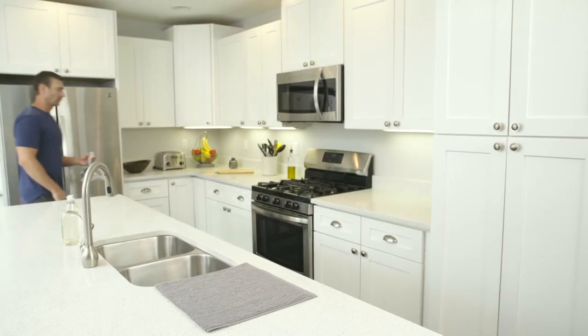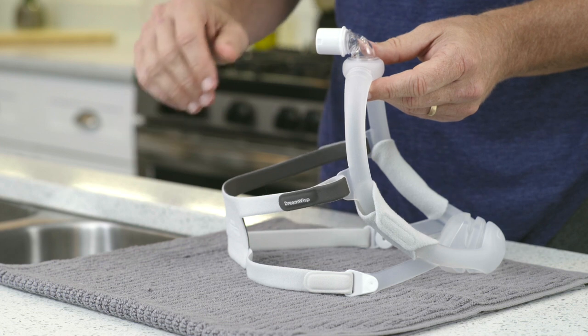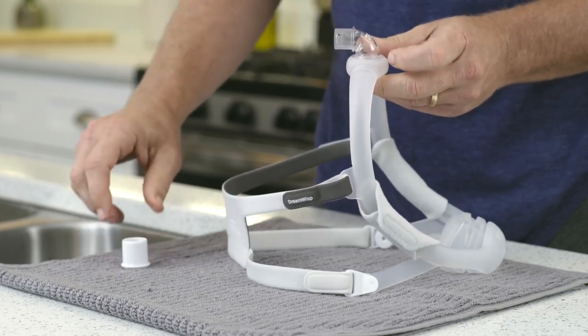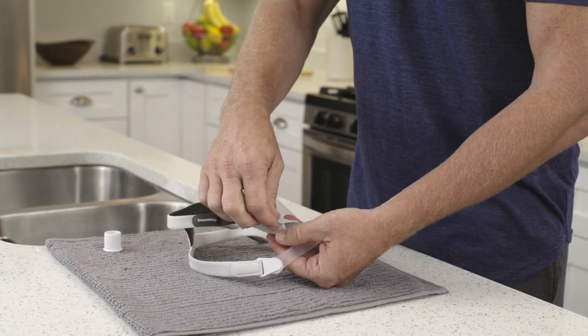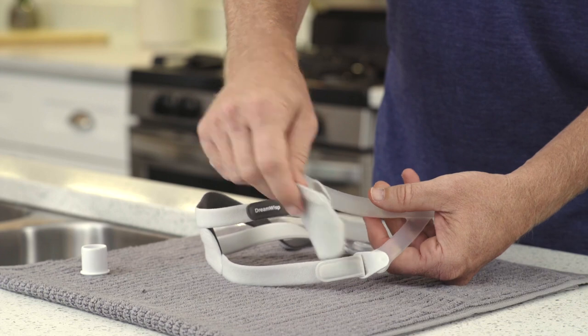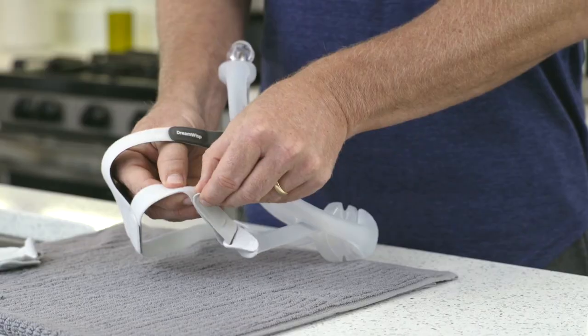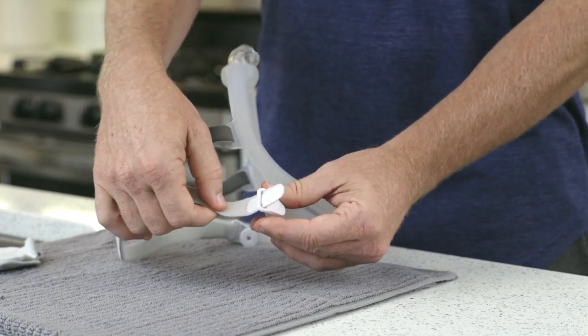Cleaning the Philips DreamWisp Minimal Contact Nasal Mask regularly and before first use is very important. To disassemble, pull the quick release from the elbow or CPAP hose. If you're using the optional fabric sleeves, undo the strips and remove them from the mask frame. Peel back the tabs on the bottom headgear strap and pull the strap through the slots in the magnetic clips.